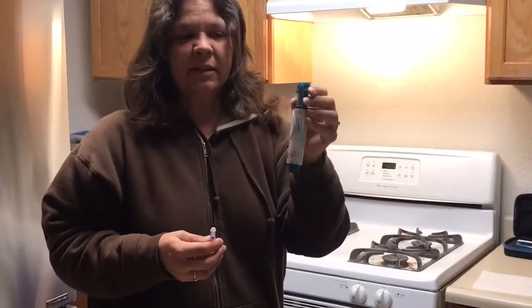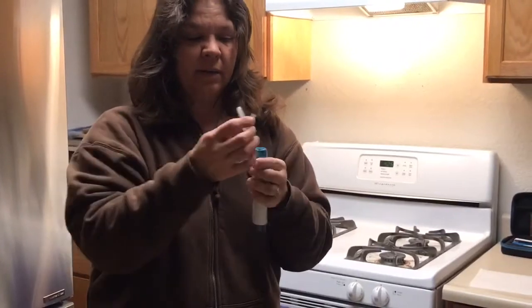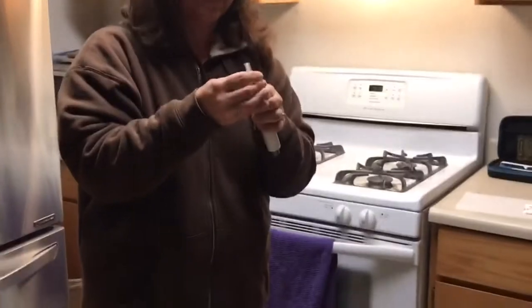This is the injector gun. It's just a spring-loaded device that shoots the medication through the needleless adapter.